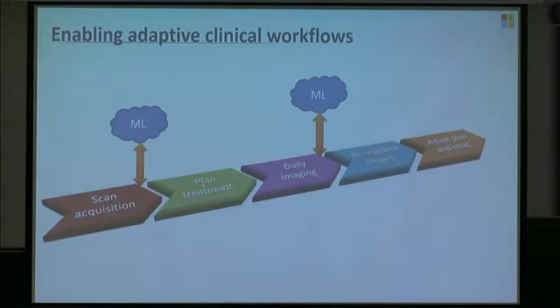We image the patient each day, which we already do at the moment, but all that we do at the moment with our images is ensure our crosshairs are aligned. In other words, are we still on target for the centre of the tumour? But instead of doing that, we take the data off into the ML, we resegment everything. So we update our digital model of the inside of the patient, replan the patient, adapt the plan, and then treat. And ideally, we want to be able to do that whilst they're on the device.